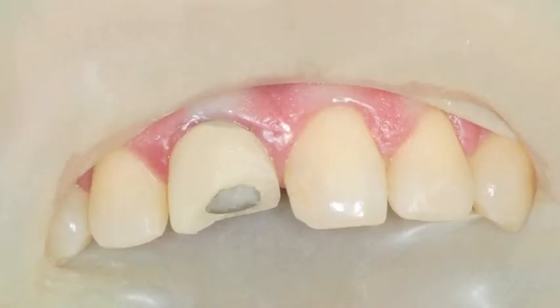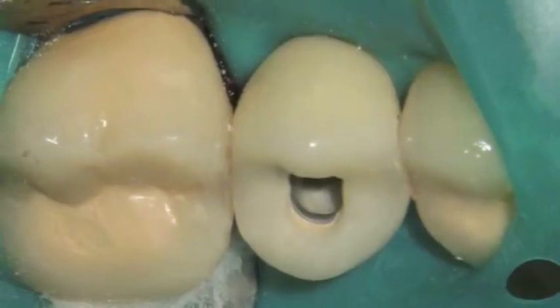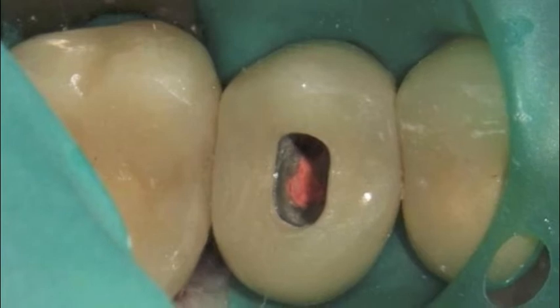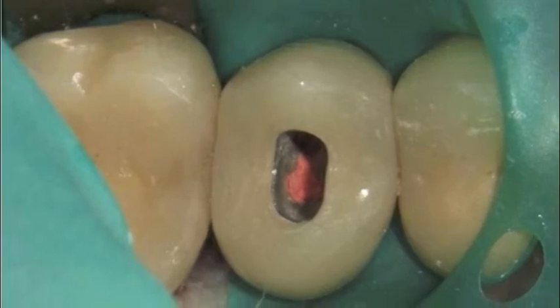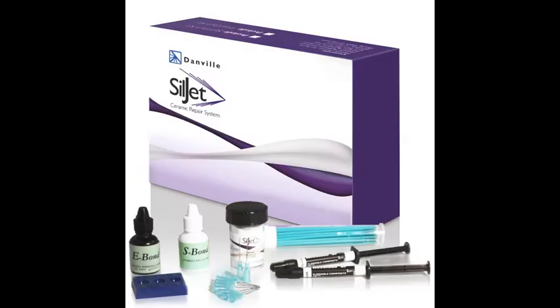When you microetch the surface with SilJet, not only are you increasing the surface area, you are nailing some of the particles into the material, which is being treated at the same time. The embedded particles are coated with silica, enabling you to chemically bond to that surface. After you microetch the surface, simply spray it off with air to remove the loose debris, and apply your silane coupling agent, S-bond, supplied with the kit.